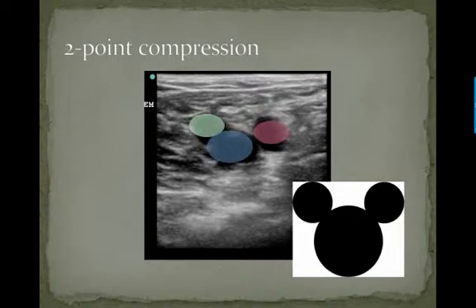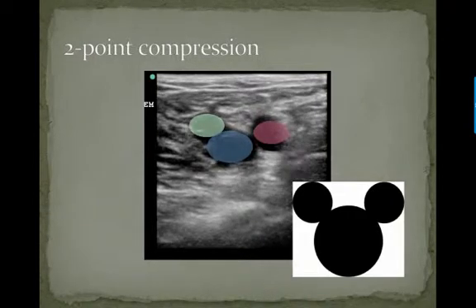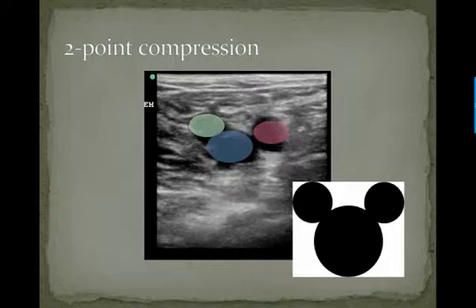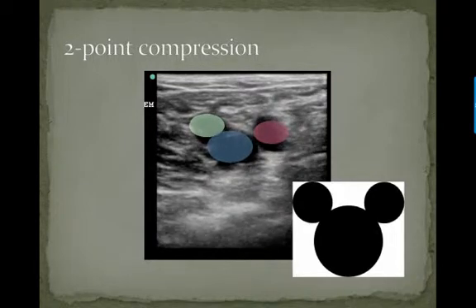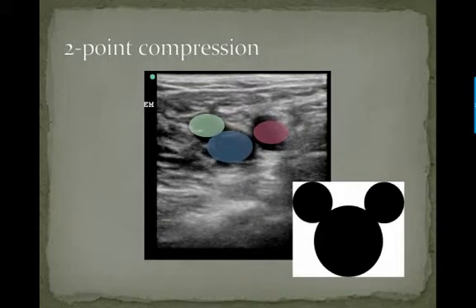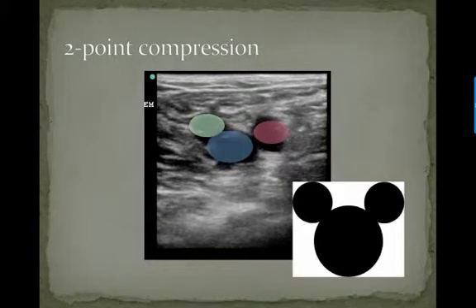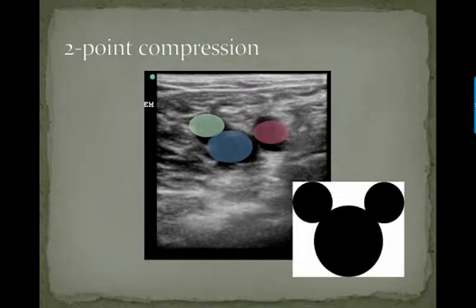Here we can see the greater saphenous in green, the common femoral vein in blue, and the femoral artery in red.